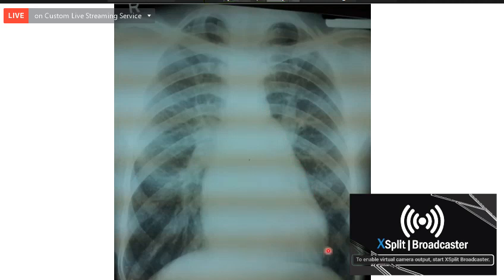Cannot be commented on, sir. It is not easy to comment, but if at all you want to comment, is it more like LV or more like RV? RV, sir. Why did you say it's RV? More like LV, sir. Yeah, I would have thought more in favor of LV.